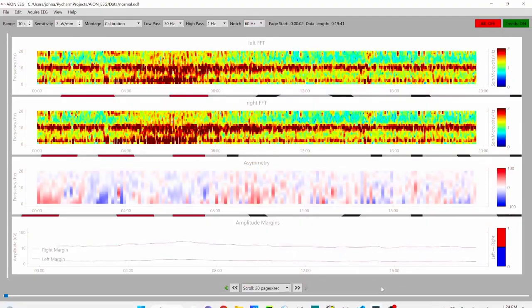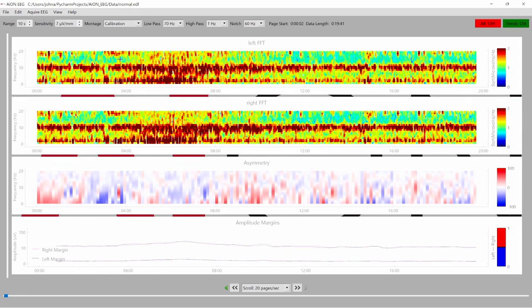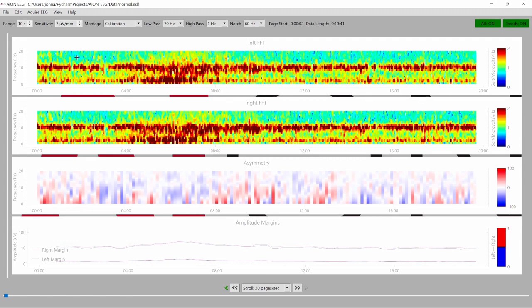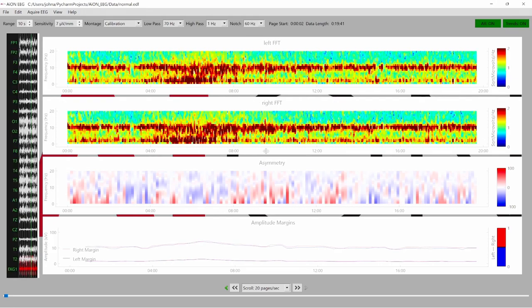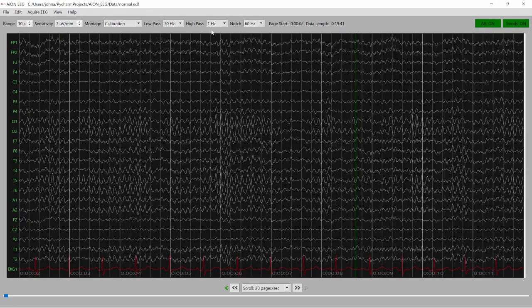Here's a picture of a normal EEG I'll show you right now on my software. If you look at our software's top two trending panels, you see the left side of the brain and the right side of the brain — they look pretty symmetric. After using our artifact reduction, we're going to see this red stripe in the middle really stand out. Around 10 hertz, right down the middle, that's showing the 10 hertz posterior dominant rhythm. That's how we read an EEG on the trends.